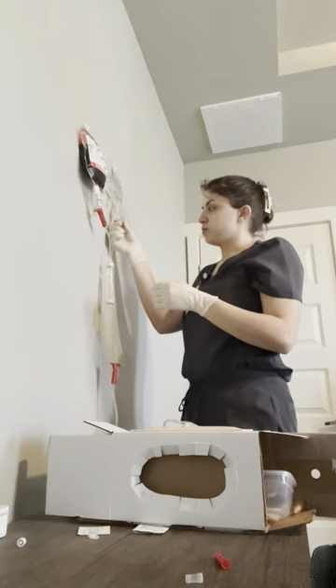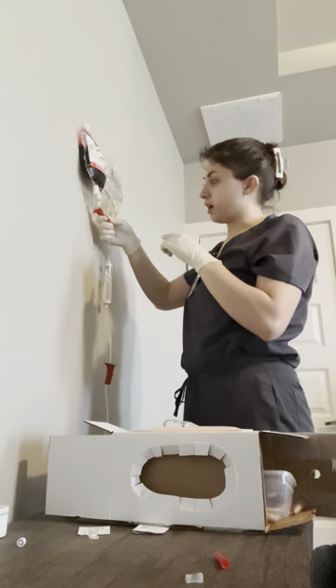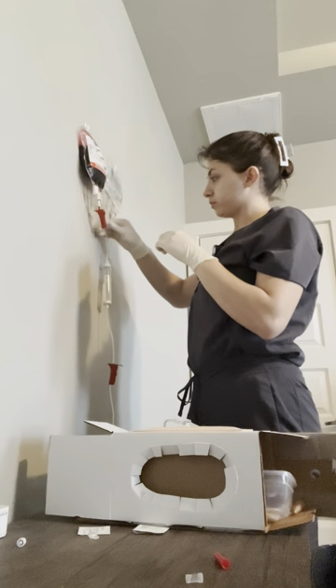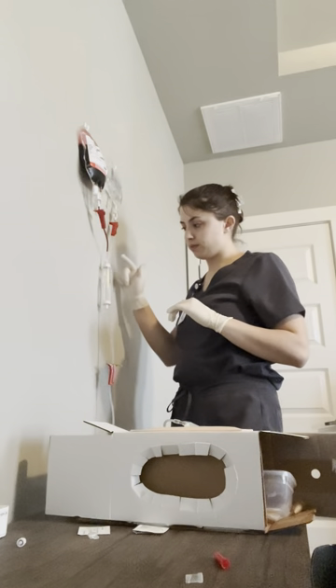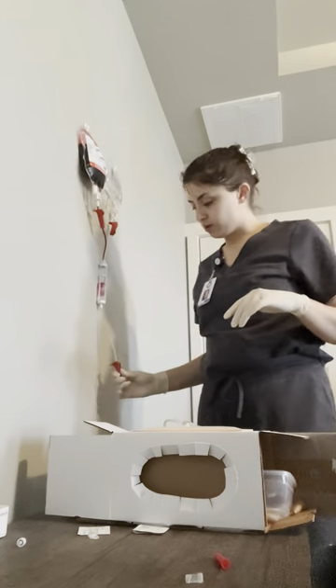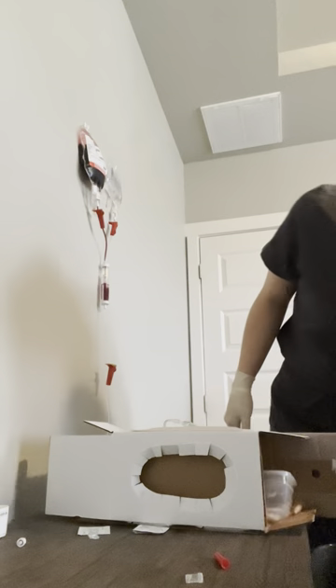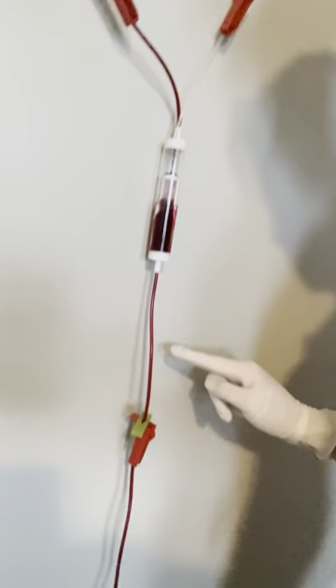Then I'm going to clamp the upper port and unclamp the blood bag port, and then I'm going to observe and make sure the blood flows through the entire tubing. It's going to go through the drip chamber, and then through the saline tubing as well. So it's gone all the way through the tubing and it's going into the IV, and you can see the blood dripping through — it is completely through the entire tubing.